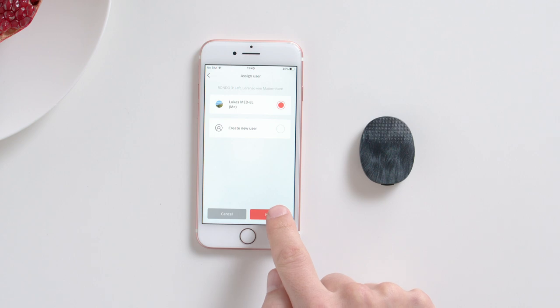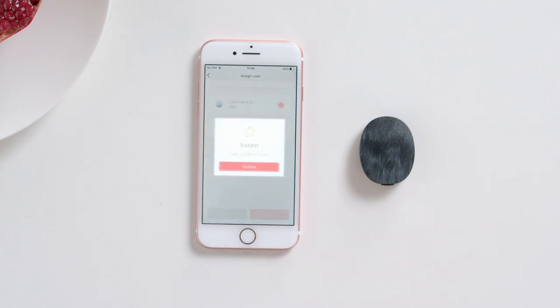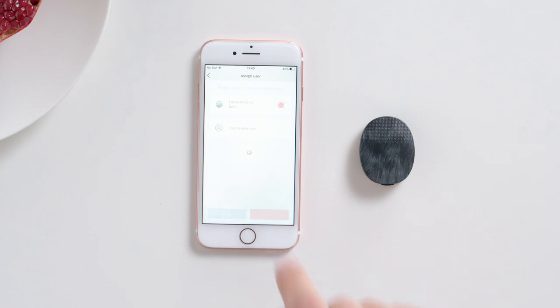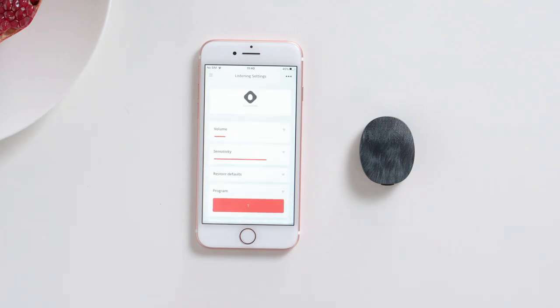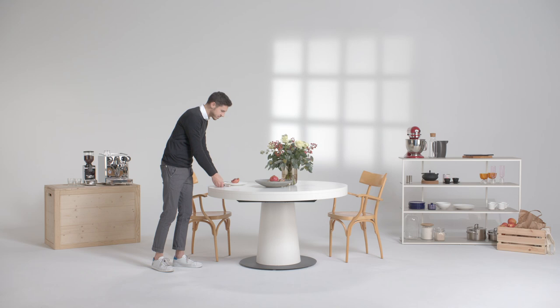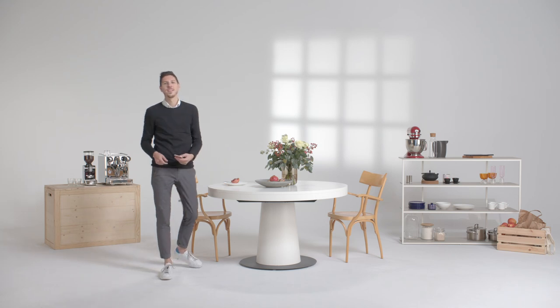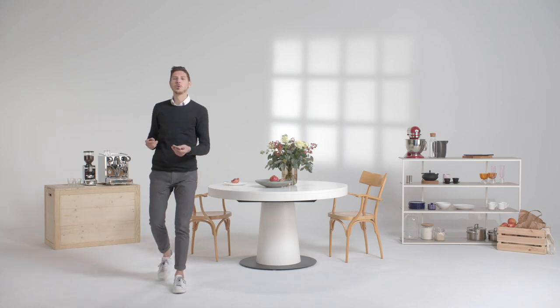Tap Create New User, then Next. Enter their name and tap Create. Your audio processor is now paired with Audio Key 2.